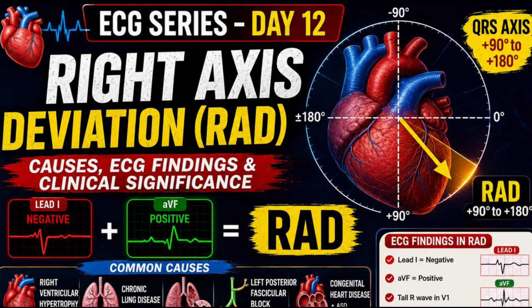So, in our previous lecture, we learned about left axis deviation, how to identify it, and its common causes.